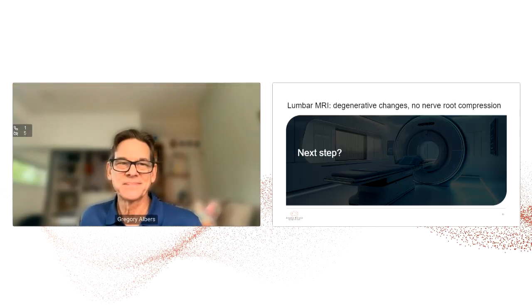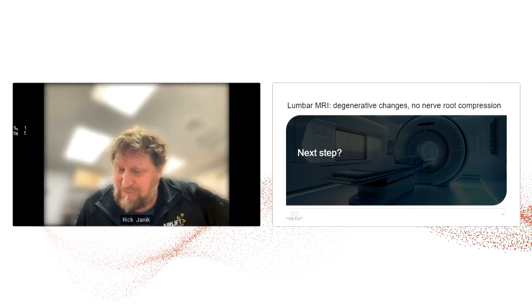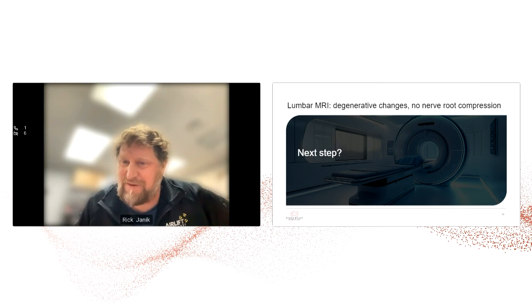Okay. Well, let's take a look. Carolina, this is Rick again. Just a quick question for the panelists with their expertise, adding a little bit of an Alaska mix. Would you move the patient to get that image? If they were 400 miles away from an MRI, how would you help us with that recommendation? Personally, I think they still need to go, but I'm just wondering your thoughts.